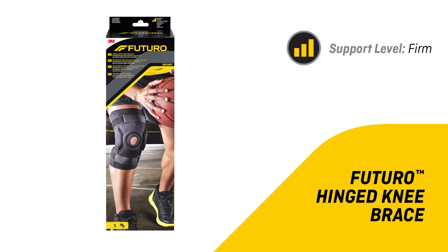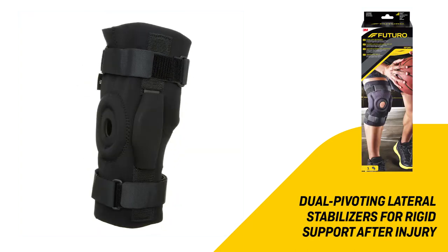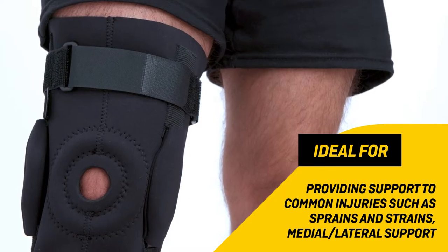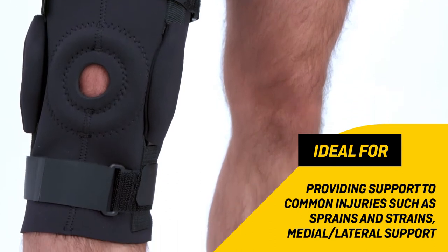Futuro hinged knee brace features dual pivoting lateral stabilizers for rigid support after injury. Ideal for providing support to common injuries such as sprains and strains, medial, and lateral.